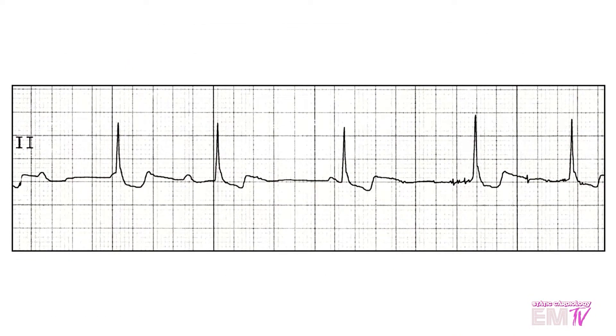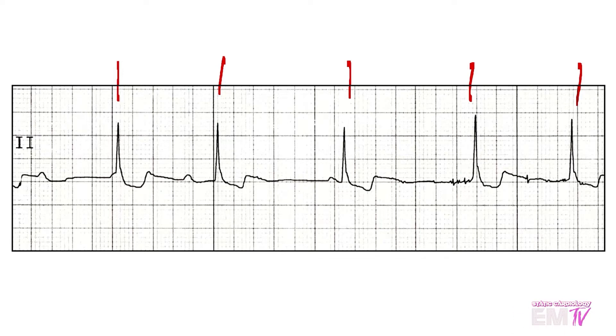The first thing I like to do whenever I identify a rhythm is to count the rate. I'm counting five R waves here, which would mean this has a rate of about 50 BPM.